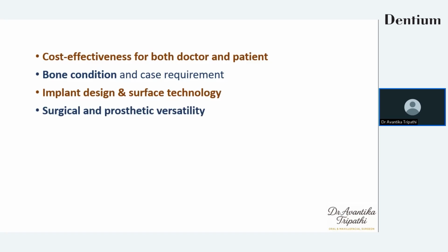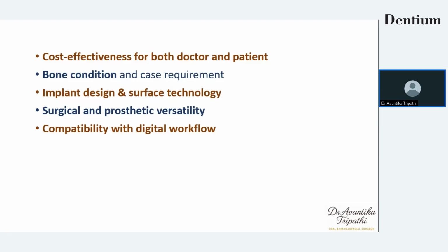Surgical and prosthetic versatility, so it can be used in all types of cases like single implant, multiple implant, or full arch cases. Compatibility with the digital workflow, as all of us want a digital system these days. Everything is digital, so a system should support the digital workflow. Ease of use and clinical predictability.